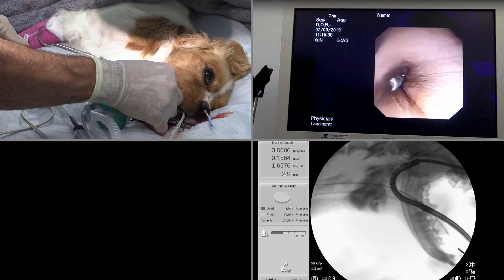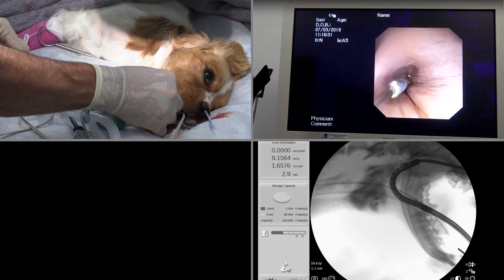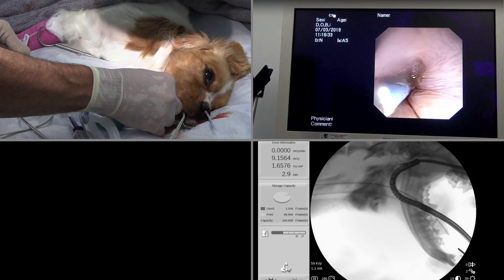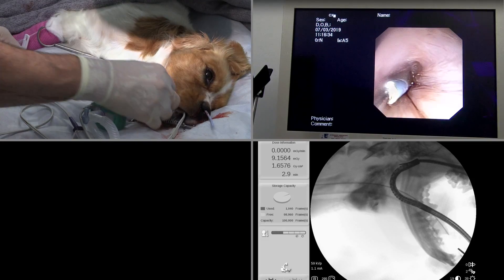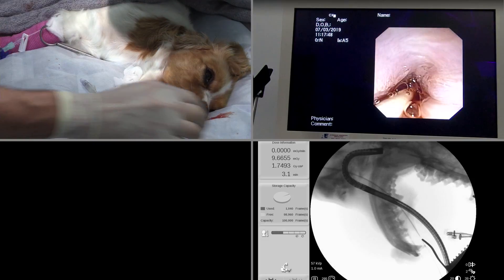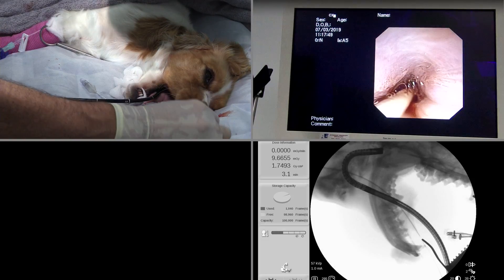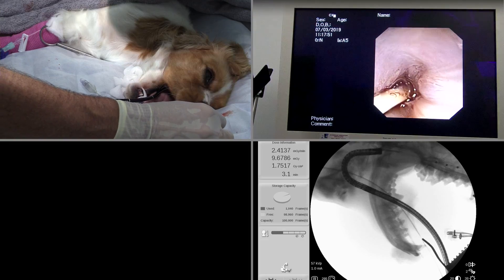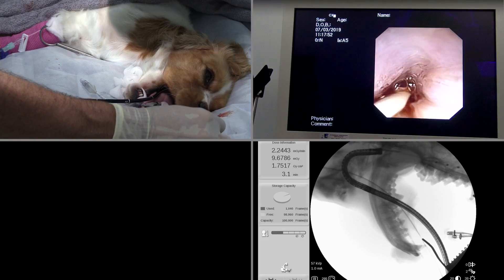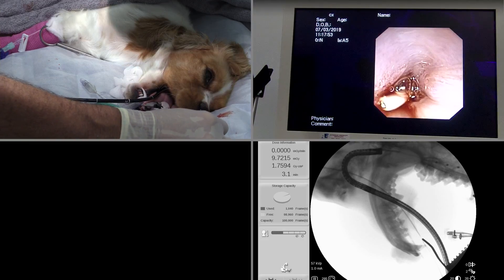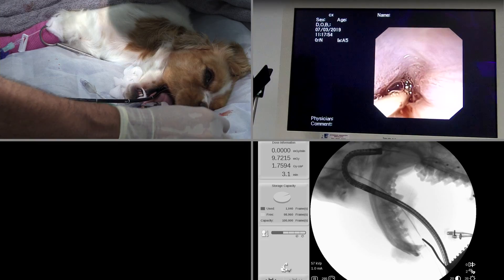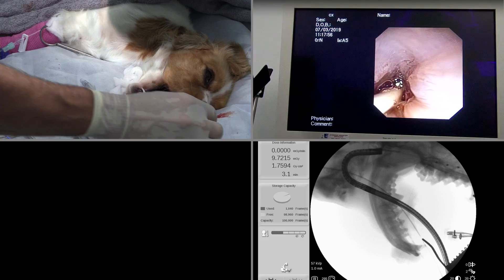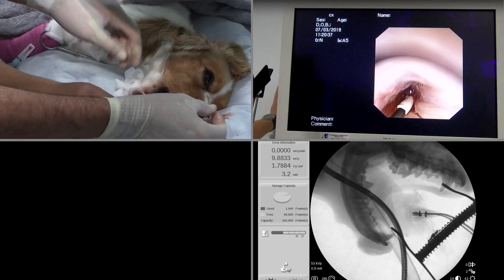Once we removed the pin, we were able to pass a guide wire through the catheter and establish patency. At that point, we passed a balloon catheter over the guide wire and inflated it.